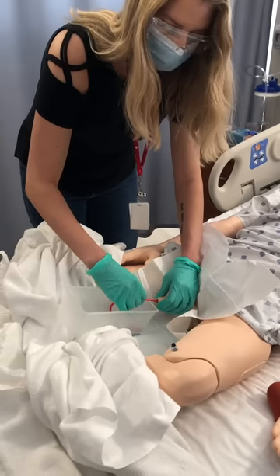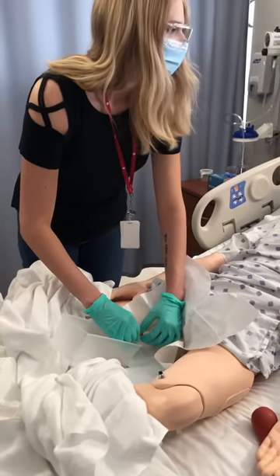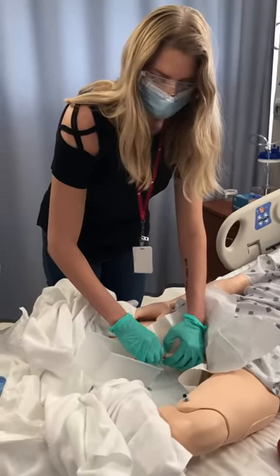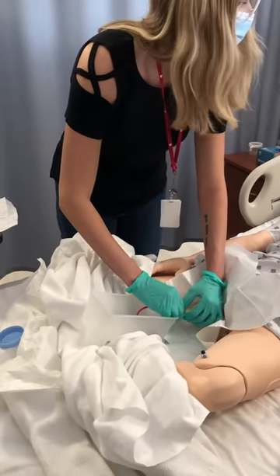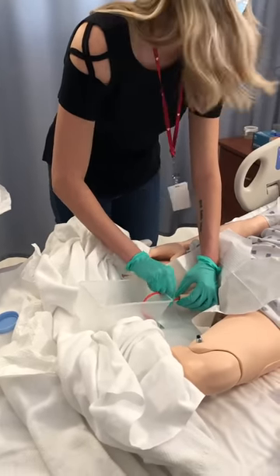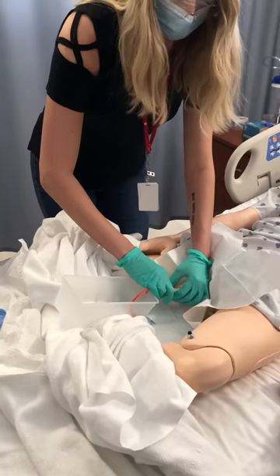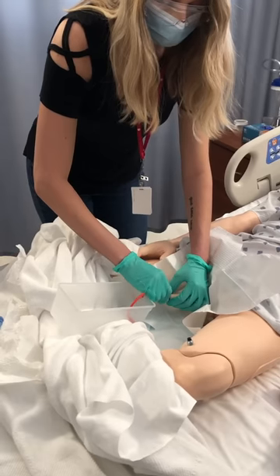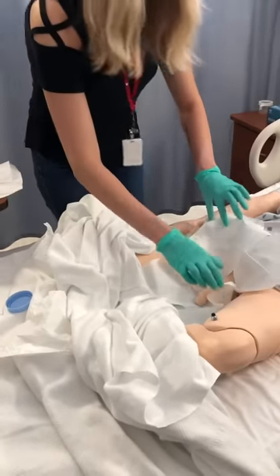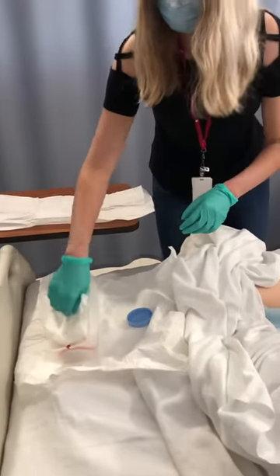Now I'm just going to give it some time so you can empty your bladder. Now we're just going to slowly pull the catheter out. And I'm going slowly to make sure there aren't any pockets of urine anywhere. Now I will clean up the equipment, and we are done with the sterile procedure.